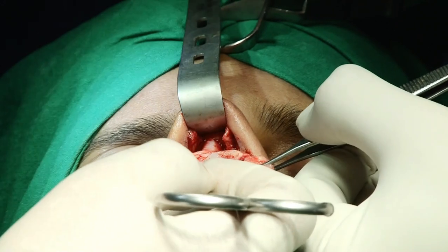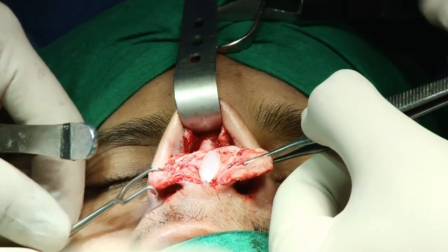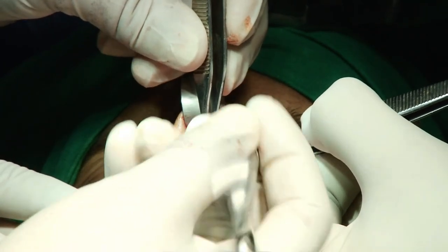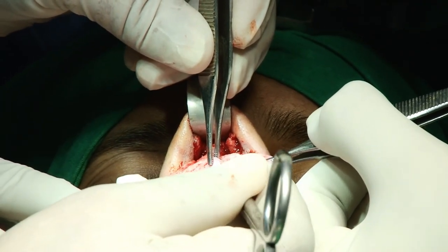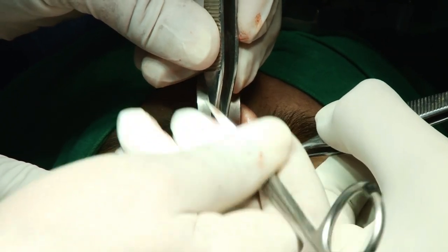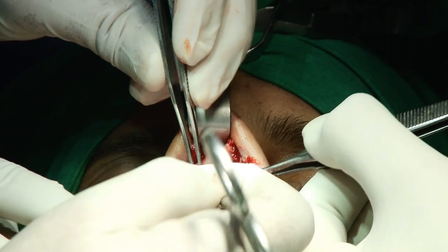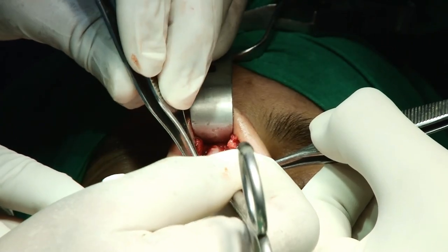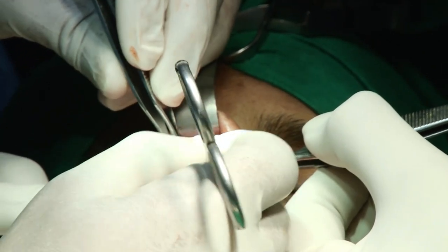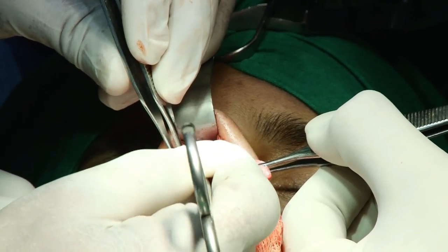This is the self-retaining lateral crus retractor. Yes, you put it like this, and then because you should expose your mucoperichondrium on both sides, you can use the periosteum elevator. I usually use this scissors. So according to your convenience, you use the instrument. Like we discussed this morning, this is the most difficult step I think in rhinoplasty, especially in revisions, when you have a twisted septum, when you have a post septoplasty patient.